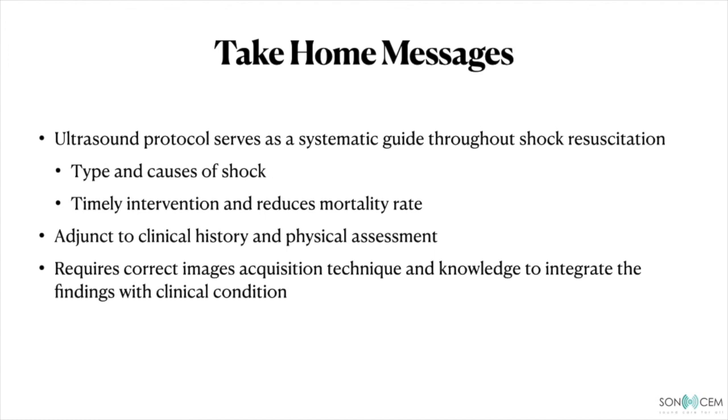But remember, PoCUS is just an adjunct to complement our history and also physical assessment, and accurate decision-making requires correct image acquisition technique and also knowledge to integrate the findings with clinical condition.